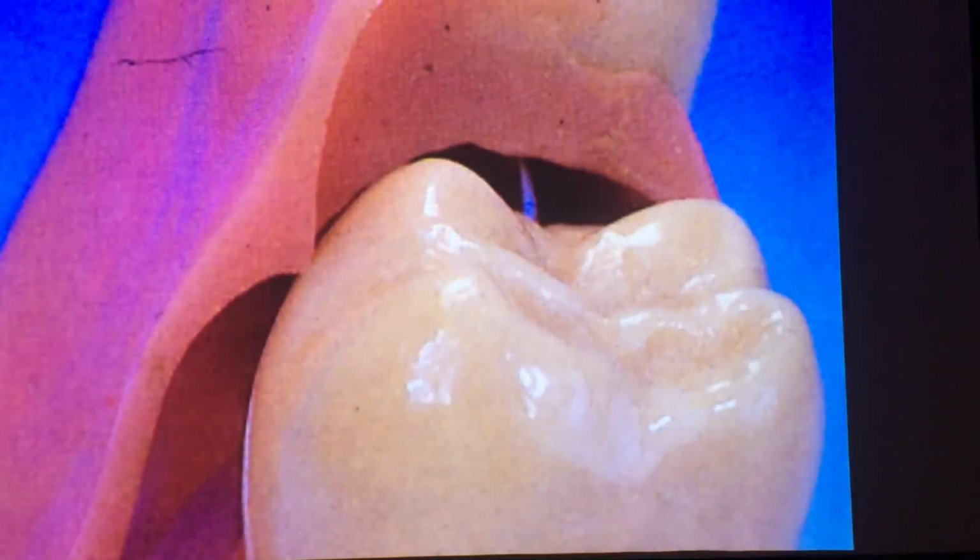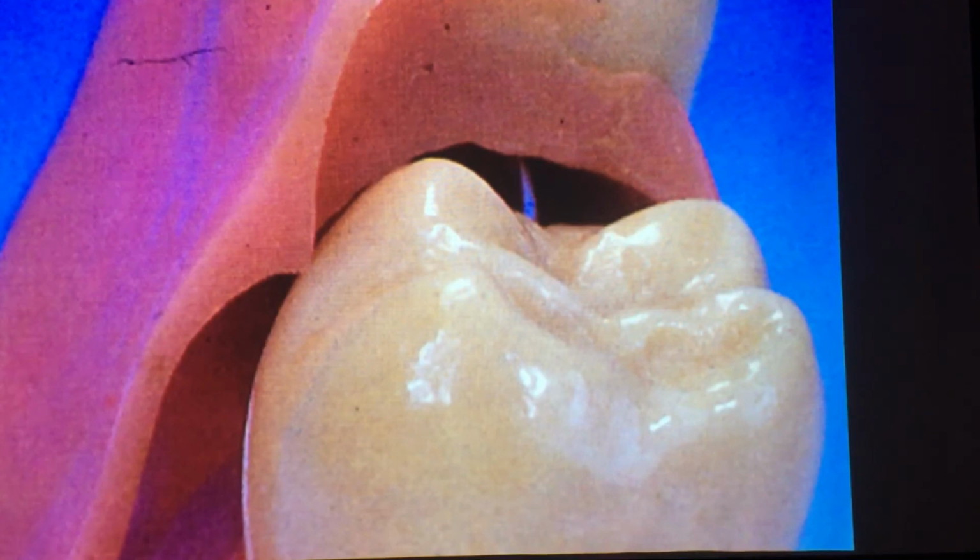Here you can see, even though it's not chromium cobalt, it's an acrylic partial model, and you can see how that acrylic is binding on the tooth. You saw this last year, and that's why I put acrylic partials before cast partials, so you can experience painfully the fitting of the acrylic partial over the abutments. Last year I said, well, how much do you relieve to make that fit over that abutment? And I said just enough. Some of you went just too much. Some of you went just not enough. You were somewhere in the middle.